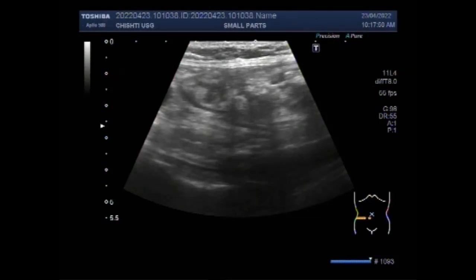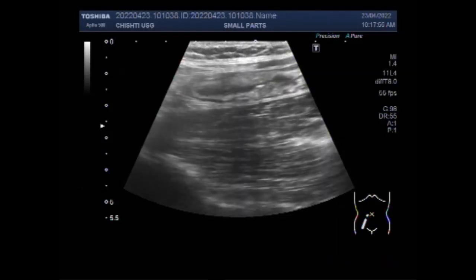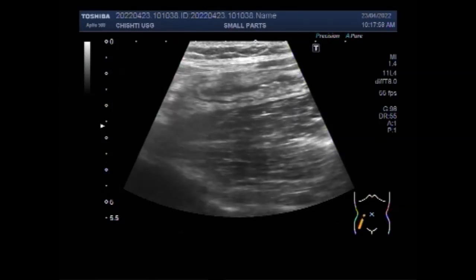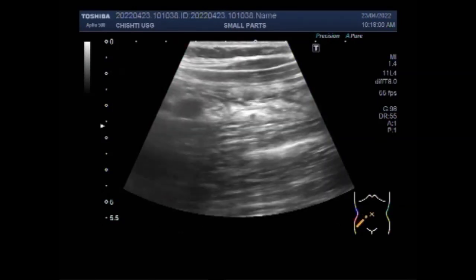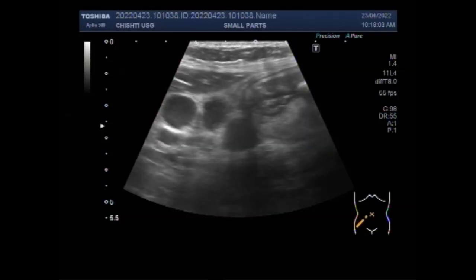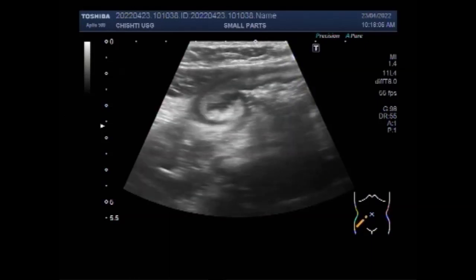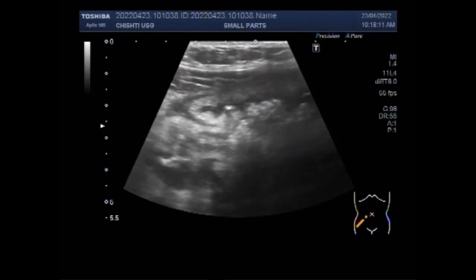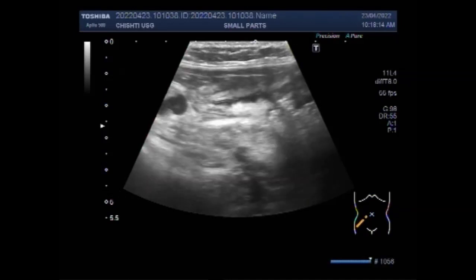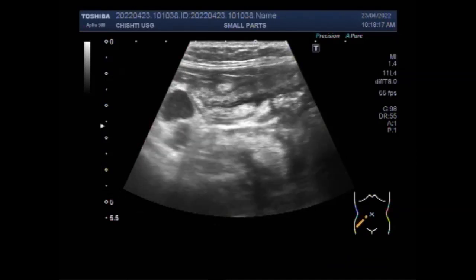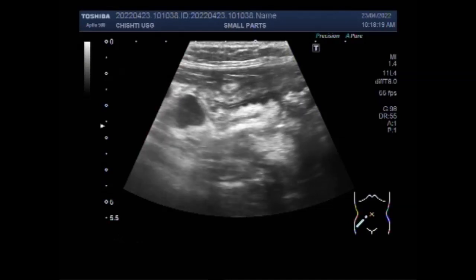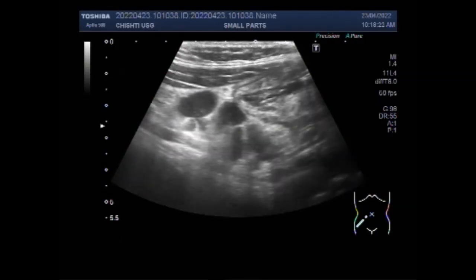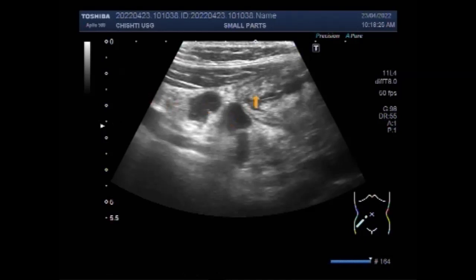This ultrasound video shows a case of enlarged mesenteric lymph nodes in a child of about six years. Enlarged abdominal lymph nodes are frequently encountered in asymptomatic children and should not always be considered abnormal. Large lymph nodes exceeding 10 millimeters in short axis in children with abdominal pain may represent mesenteric lymphadenitis of various causes. The area of scanning is the right iliac fossa, where multiple lymph nodes are visible.